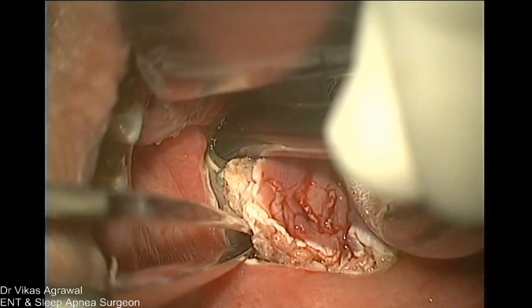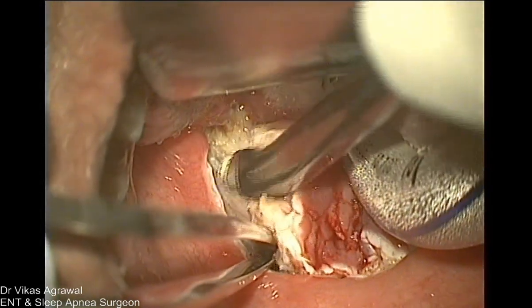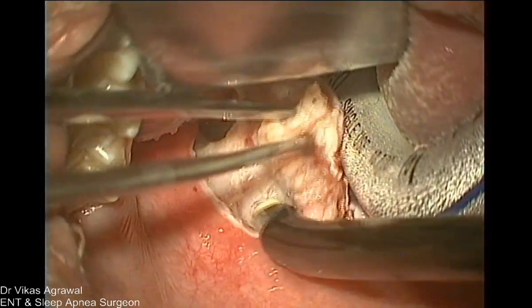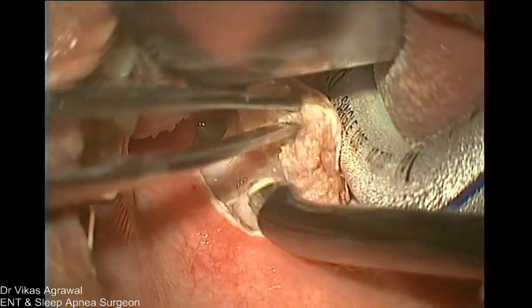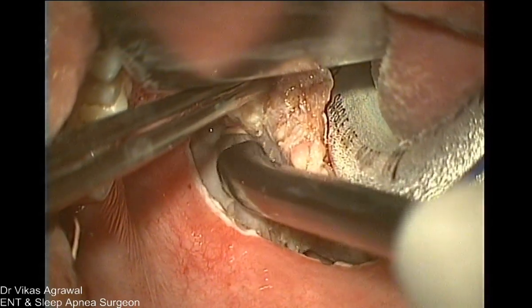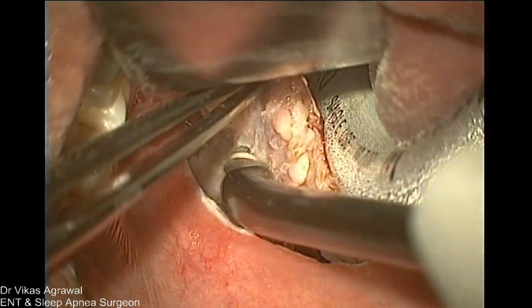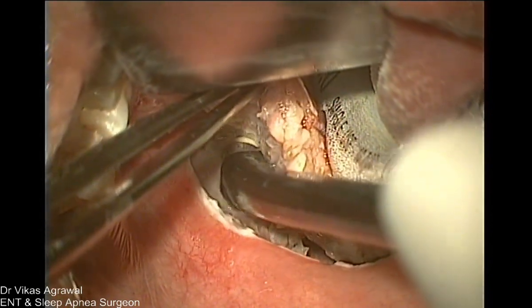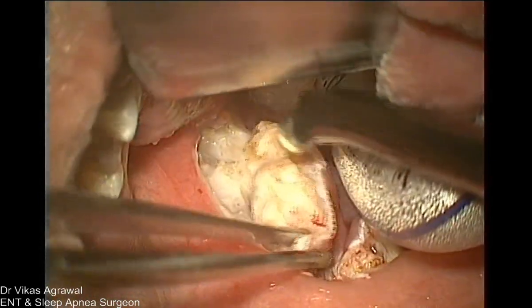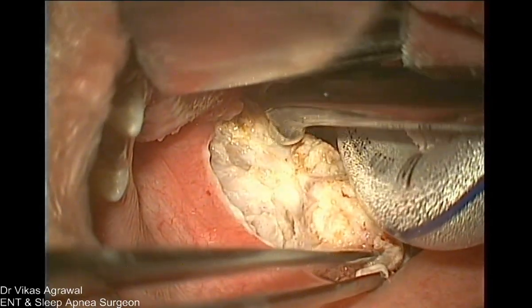So we'll coagulate all around and behind the tonsillar artery so that the whole artery length is coagulated. Once we do that, the bleeding will not happen, because the caliber of the artery behind the open end has already been coagulated. Now there will be small vessels here, we need not bother about them. We'll get one big vessel in the posterior pillar. So now this is the posterior pillar, and we have removed the tonsil.